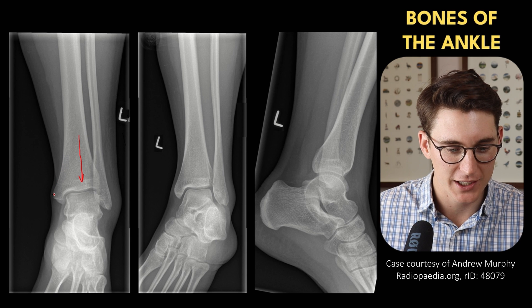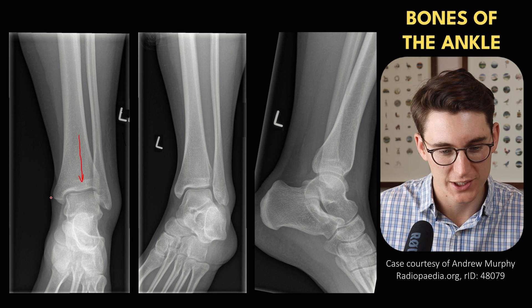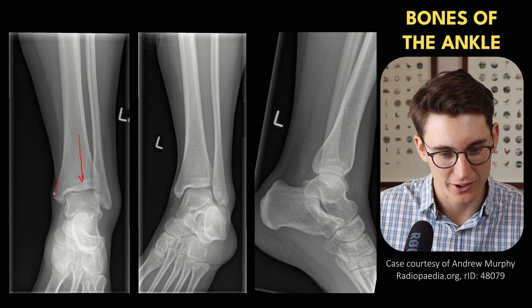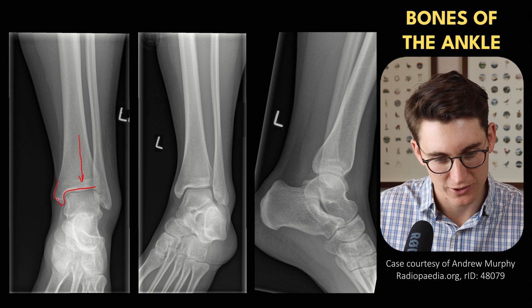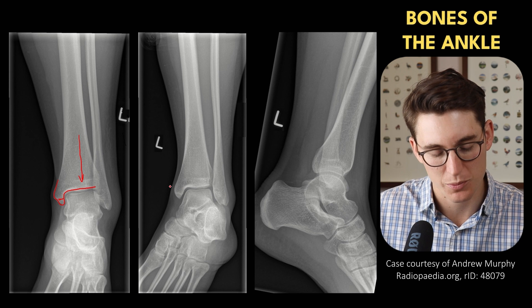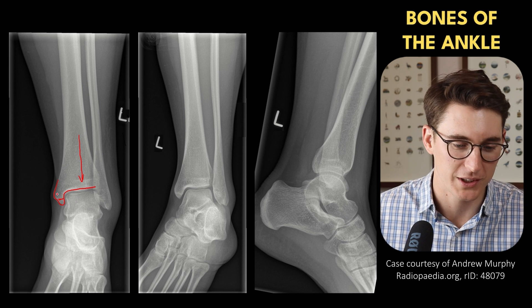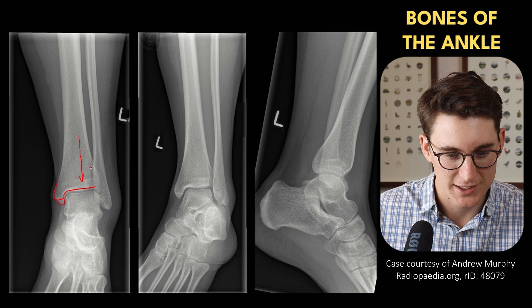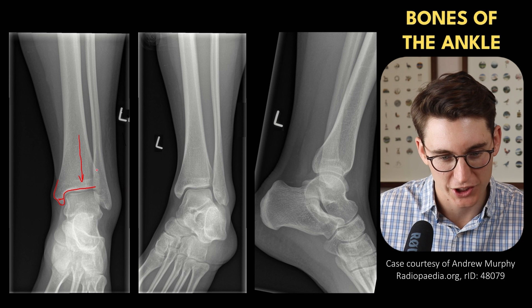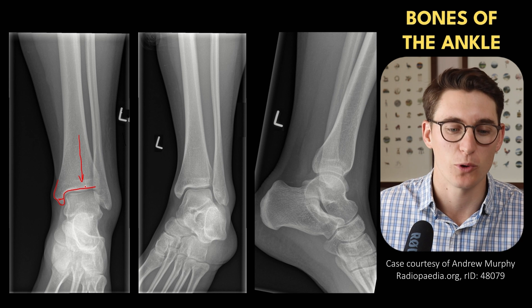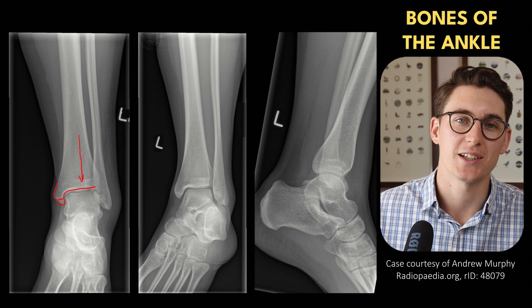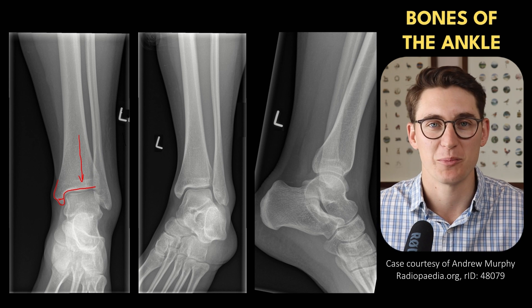The tibia has a medial and inferior process known as our medial malleolus. We can see that the medial malleolus extends right the way down and then out to the tibial plafond. We can also see a little sclerotic line which corresponds to the posterior portion of our medial malleolus. The tibia has a fibular notch in which the fibula sits — this is our tibiofibular syndesmosis, the distal joint between the tibia and fibula, which we'll look at in more detail later.